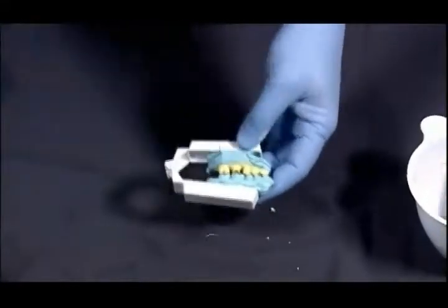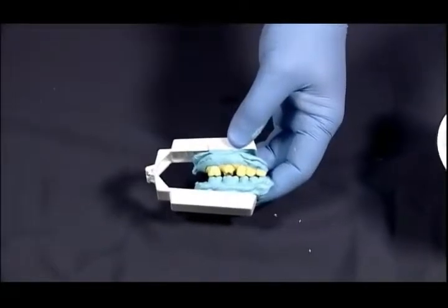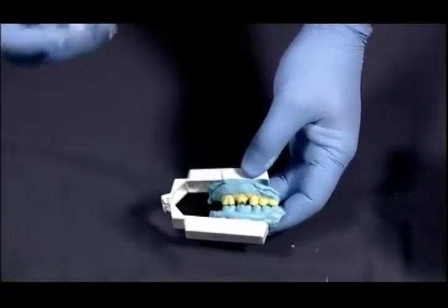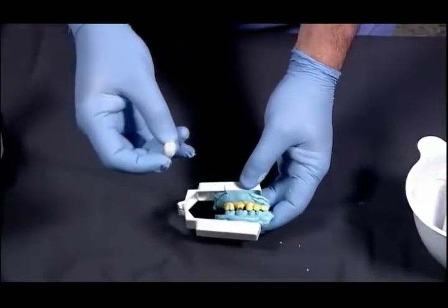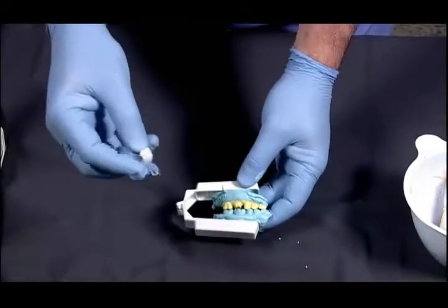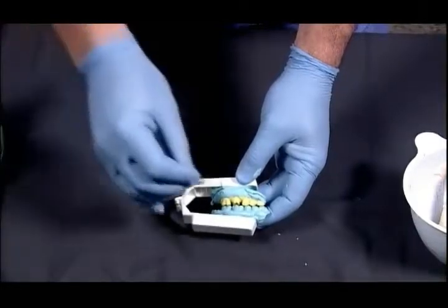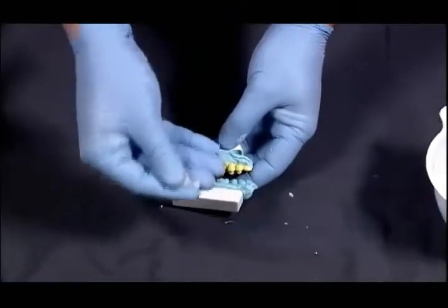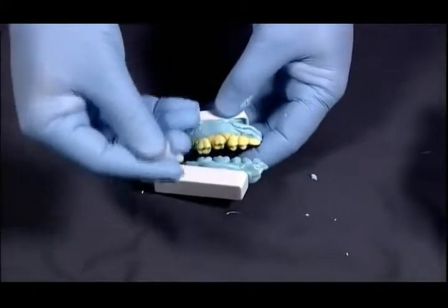Now this is something that you are going to be delegating to your assistant. But in this process, you will pick the appropriate shell, and the shells are numbered per tooth. So there's a small, medium, and a large for each of the posterior teeth in the mouth. So this particular tooth is tooth number 3. This is a number 3 medium-sized shell, and I'll be trying it on. On the tab will be a number that will correspond. It'll say 3M for medium.